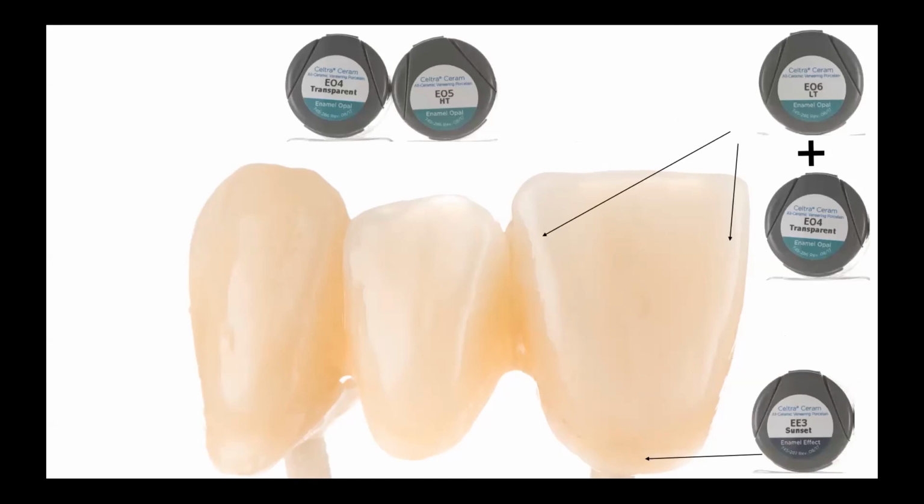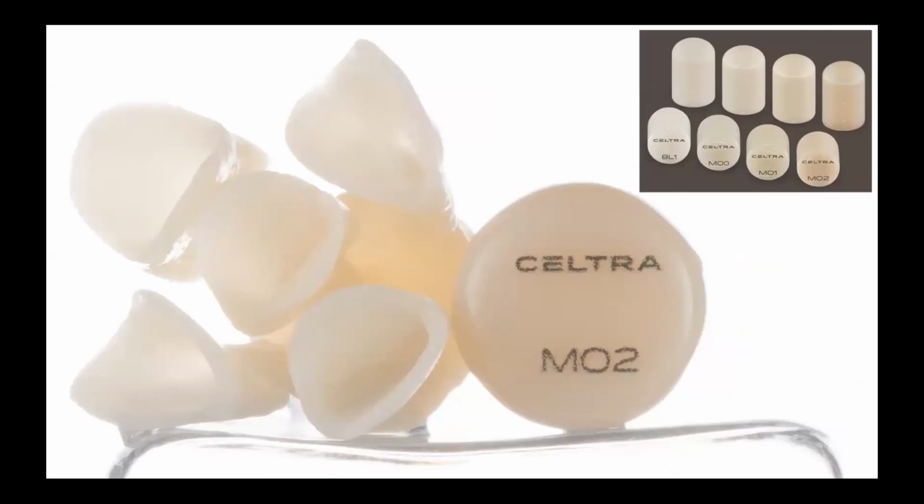After that, I overlap everything with transparent opalescent enamel in the enamel segment, and with translucent opalescent material in the middle segment of the restoration. And I can use an enamel effect like sunset. This is the orange enamel effect to increase chromaticity of the area of the cervical aspect.